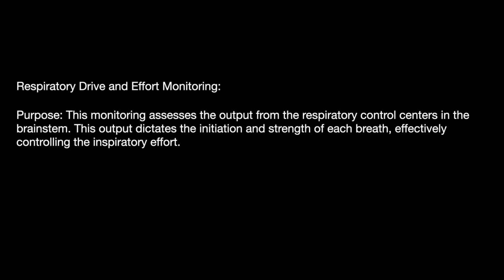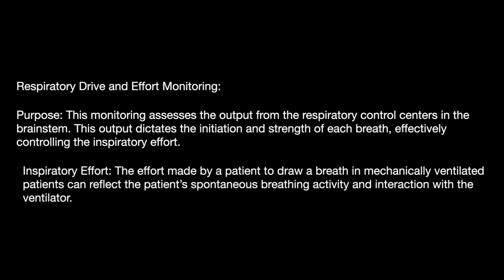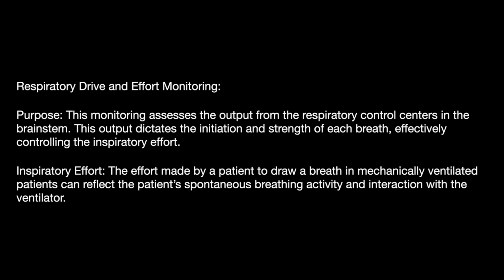So what we are trying to find are surrogates or non-invasive measures which can help us in finding the patient's respiratory effort. This monitoring assesses the output of the respiratory control center in the brainstem, which dictates the initiation and strength of each breath, effectively controlling the inspiratory effort. The effort made by a patient to draw a breath in a mechanically ventilated patient can reflect the patient's spontaneous breathing ability and interaction with the ventilator. So the methods that we are going to discuss now are the non-invasive methods.